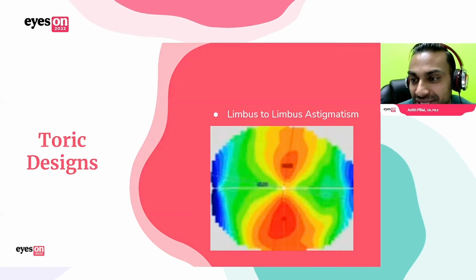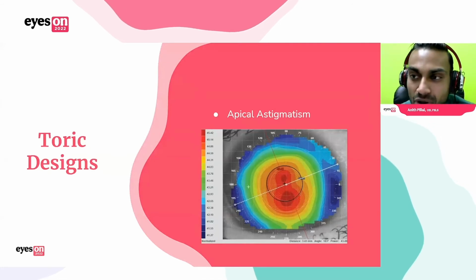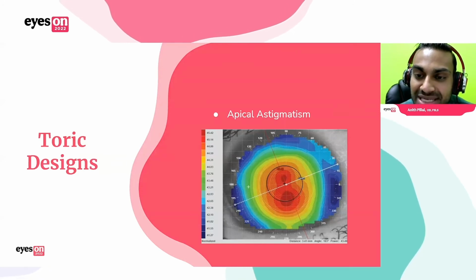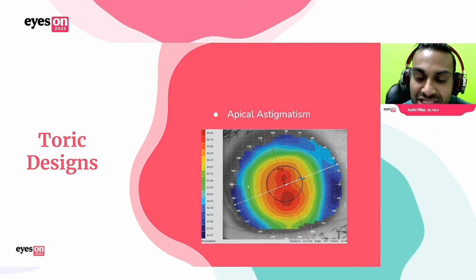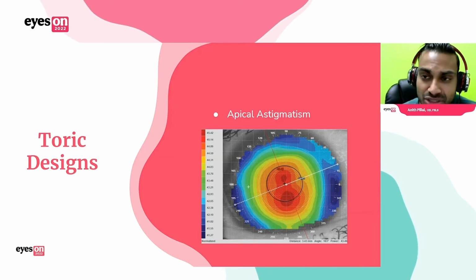So that's treated differently. And for most apical astigmatism, which was this here, right in the center, you can correct almost all of that with a central design. You can see that the mid-peripheral cornea is fairly symmetrical. You're not seeing big elevation differences. So you could probably fit that with a spherical design and have great success. With limbus to limbus, there's more likely big elevation differences, so you'll need a toric design.